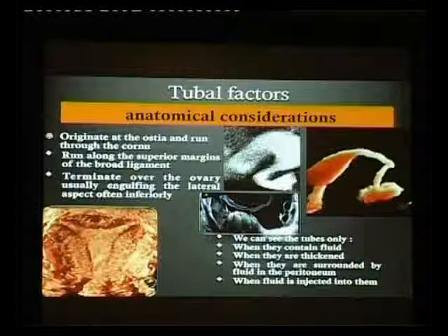Then we move on to the cervix, which is of course tricky to visualize properly. It is important to see if the cervix is bulky or edematous. Nabothian follicles are common and may be associated with healing, which may indicate a chronic cervicitis, and therefore we may also look at such patients who have cervical polyps, which may cause bleeding, and approximately 8% of leiomyomas, we must remember, they occur in the cervix, and we may identify them with a vascular stalk.